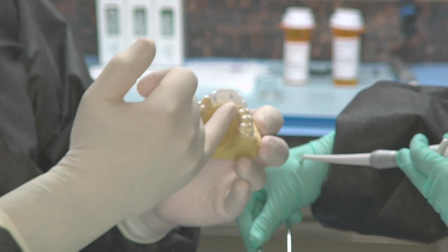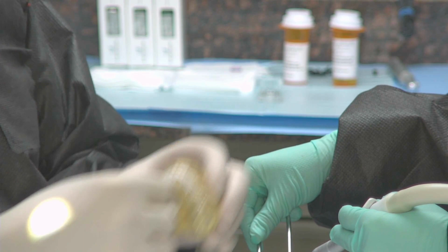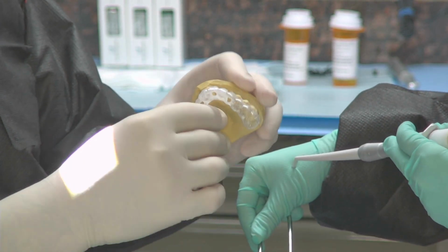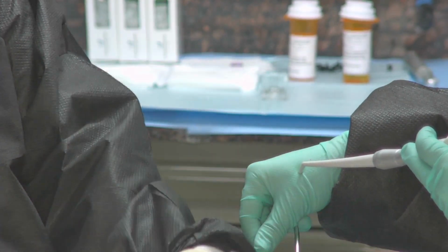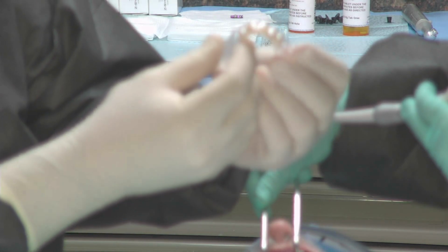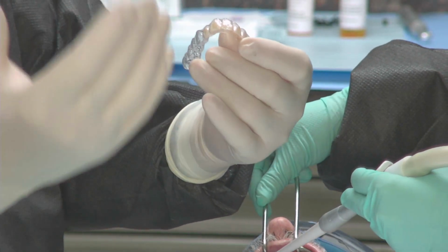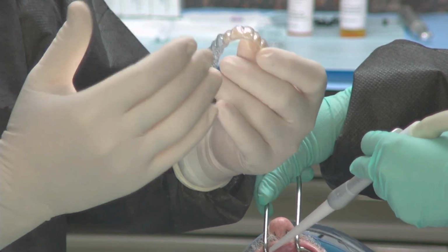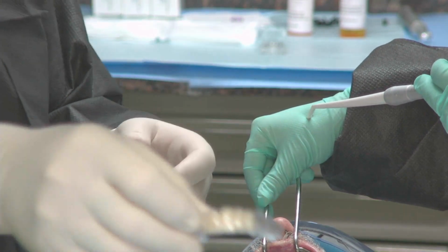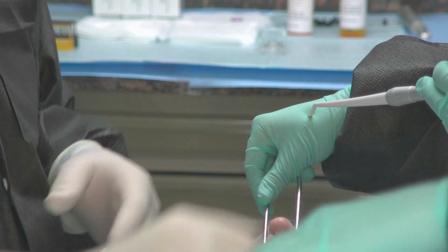And then from here, I create my access opening areas for my surgical guide. But also from that, we then go ahead and fill this with acrylic, it goes on our model, and then we create our surgical guide, but it's also our provisional restoration. I trademarked this about 15 years ago. It's called a temp stent. We'll be seeing this later in the course. But it's really an ideal way that we can go back and simply convert the provisional restoration. All right.